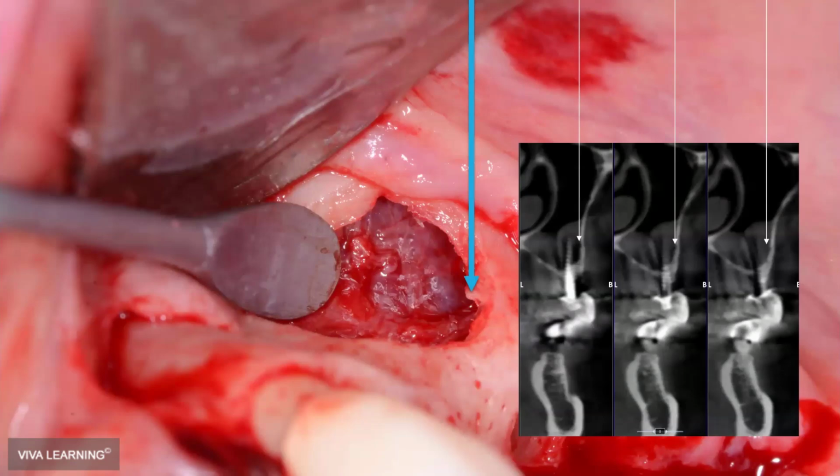And you want to know where it is so that when you're accessing your lateral window sinus, you can either avoid it or prepare for it. Because these bleeds, while not life-threatening by any stretch, can be annoying, and they can stop your ability to see and efficiently do the surgery. And so I just thought this was a cool photo showing just the small size of that little notch and that it did show up on the CT.